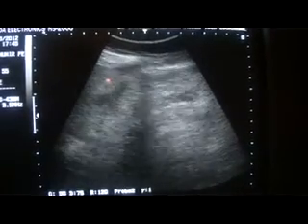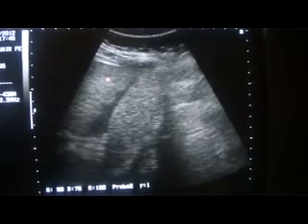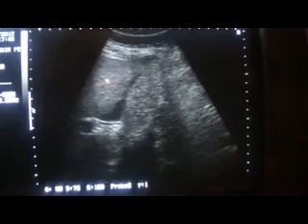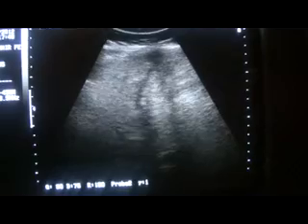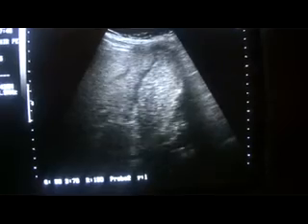separately. Rather, a hypoechoic rim is seen surrounding this distended gallbladder, which makes our differential a bit difficult, as in this case we have to report that the possibility of any aggressive pathology cannot be ruled out. So you see, this is how we study the gallbladder pathology.